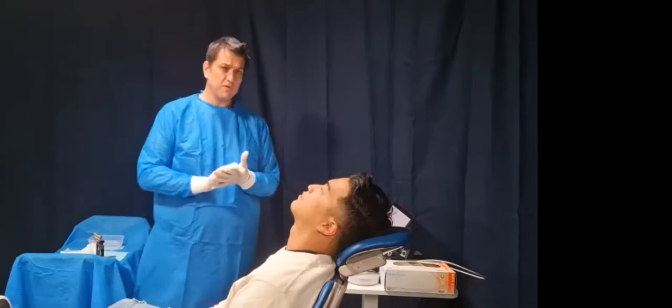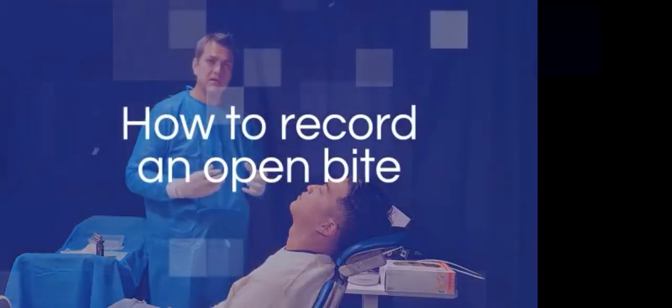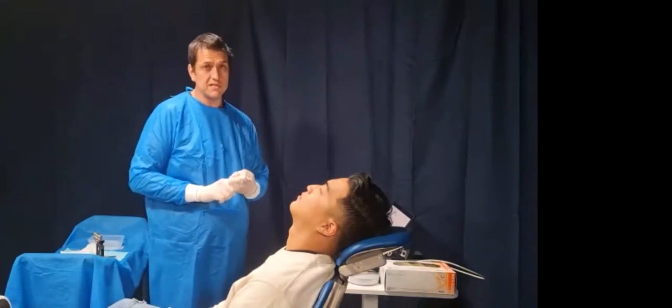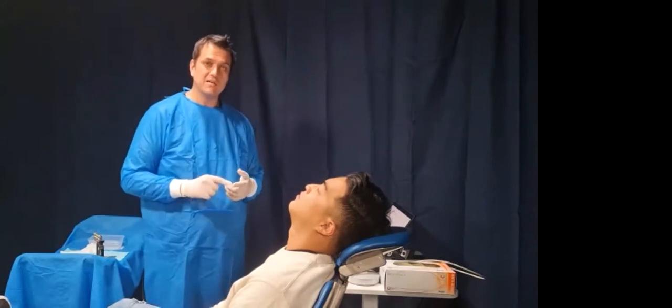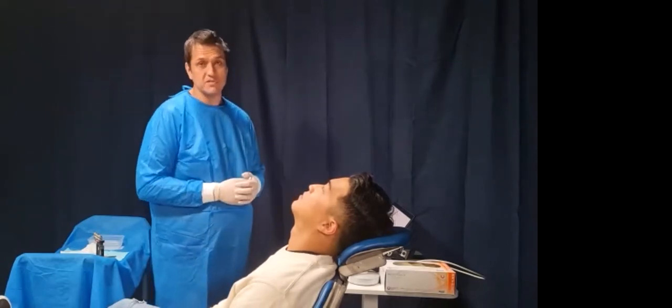So we're going to go through a few things today, and we're talking all about occlusions. I will look a little bit at the complex partials that we talked a bit about in the debrief last week, but specifically we're going to look at how to record an open bite. Now that can be very handy, especially in two indications. One, your occlusal splints, and dentists do a lot of those, obviously, to protect the teeth. And so what we want to do is actually open the bite with our scan, or record the open bite position with our scan.